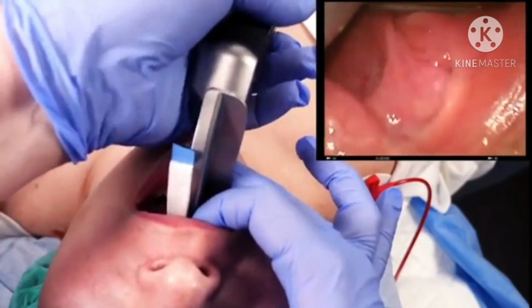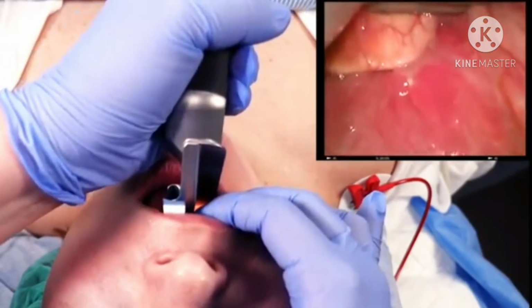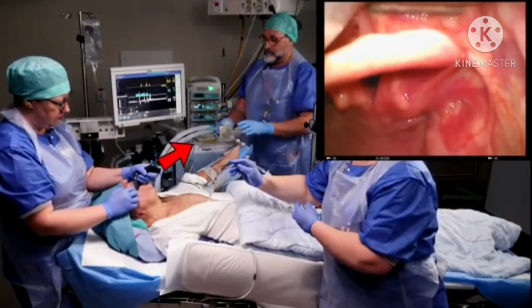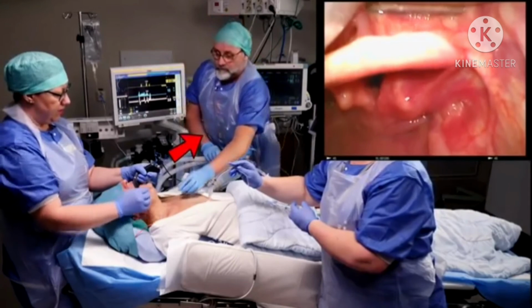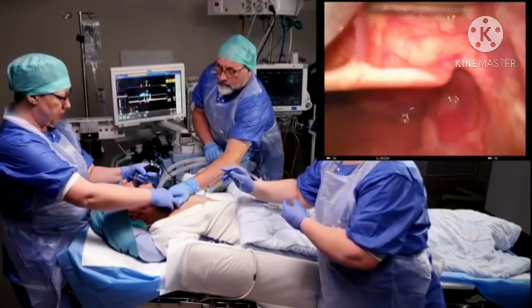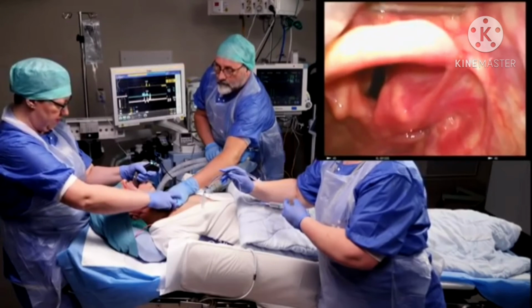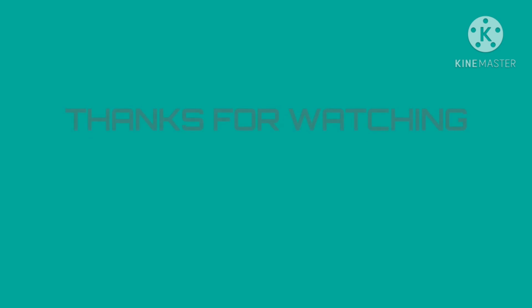Advance the blade until you see the epiglottis and place the tip in the vallecula, the recess at the base of the tongue. At this point, you can start to apply some force in the direction of the laryngoscope shaft. Sometimes a light external force on the larynx can make the vocal cords spring into view. Ask for your assistant's hand and move it to apply backwards, upwards, rightwards.